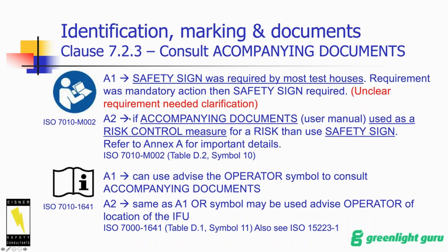So this is your least desirable means. You want to design in something safe. That is your top priority, and especially in an electrical medical device. So this is a big deal.